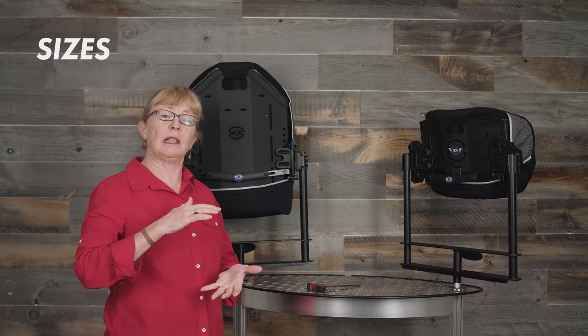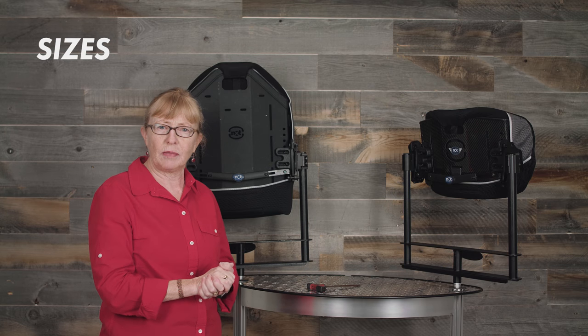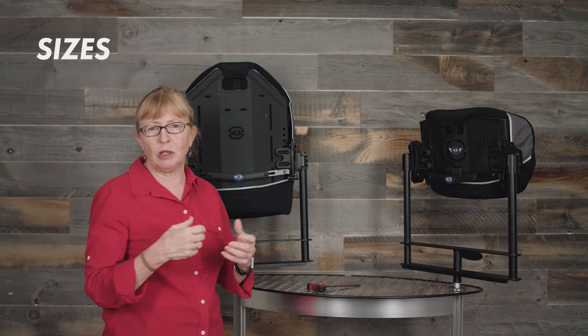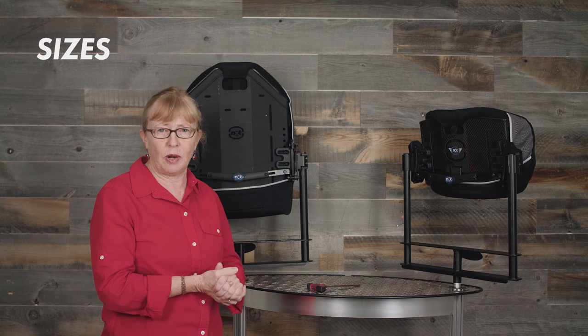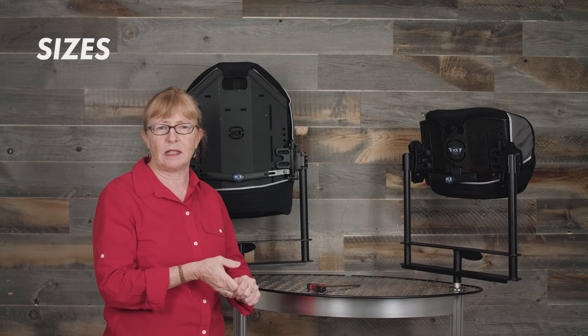It comes in lengths of 9, 13, or 16 inches. The Optima is available in widths from 14 to 29 inches in one-inch increments and is available in lengths of 9, 13, 16, and 19 inches.